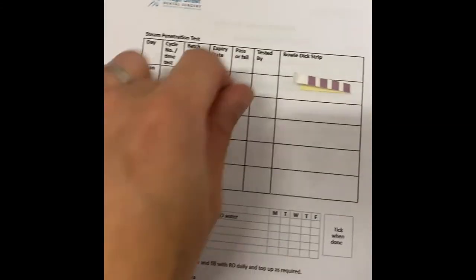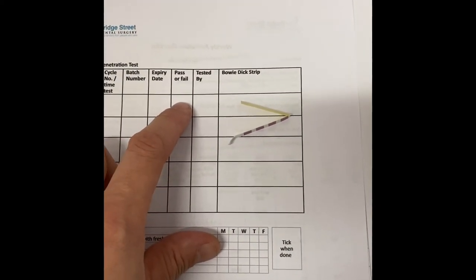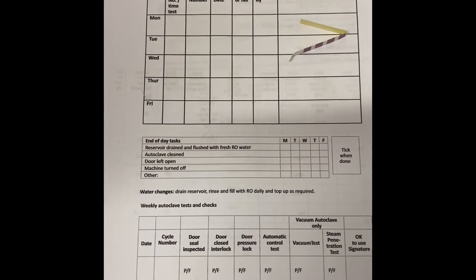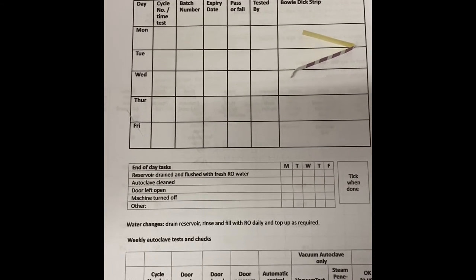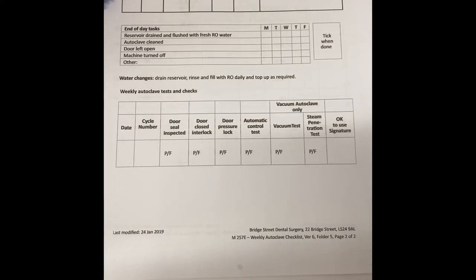The batch number is located on a little strip. These ones don't actually have an expiry date. We basically pop whether it's passed or failed and who's tested it. At end of day, we just need to record that the reservoir has been drained and flushed with fresh RO water, the autoclave needs to be clean, the door needs to be left open, and the machine needs to be turned off.